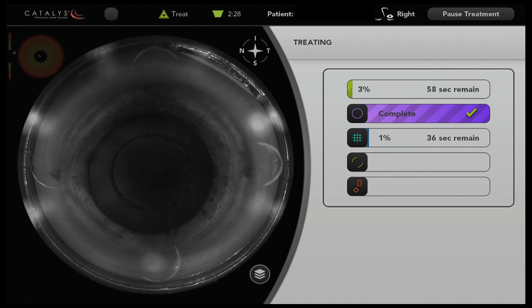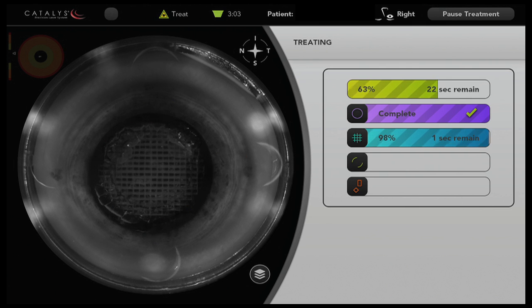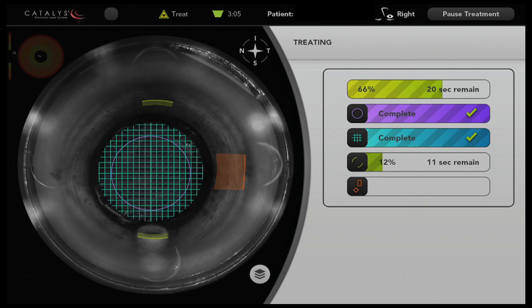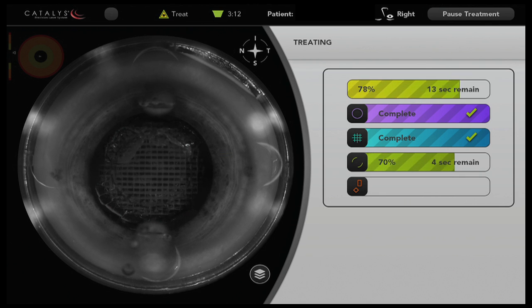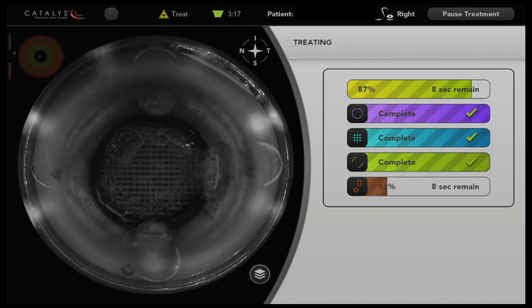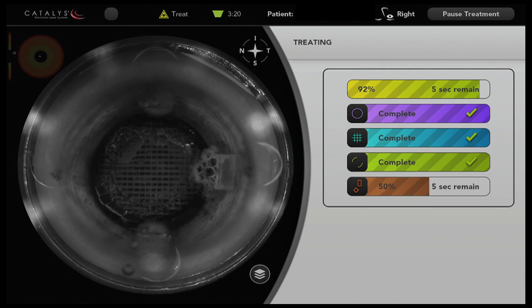Capsulotomy is completed in under two seconds and the lens is softened using a 350 micron grid spacing. Two corneal relaxing incisions are then placed at the nine millimeter optical zone at a depth of 80% and an arc length of 24 degrees, and a temporal corneal incision is placed as well.